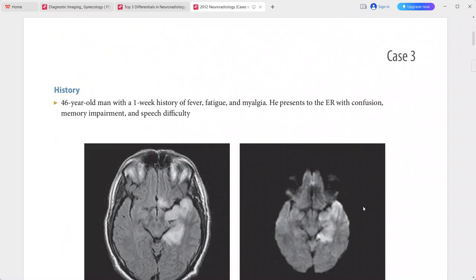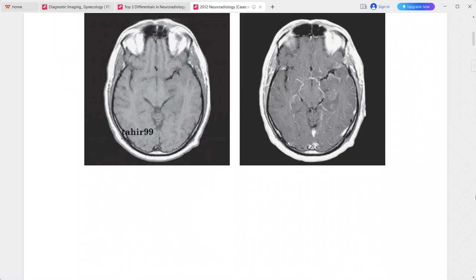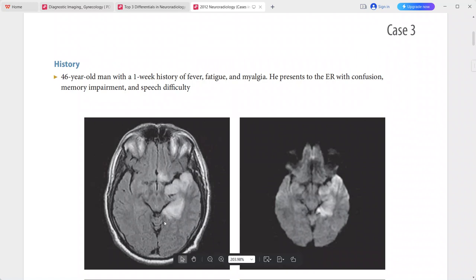Next case: 46-year-old man with a one-week history of fever, fatigue, and myalgia, presenting to the ER with confusion, memory impairment, and speech difficulties. The FLAIR sequence shows hyperintense signal involving the cortex and adjacent subcortical white matter of the medial and anterior left temporal lobe, as well as the posterior aspect of the left gyrus rectus.